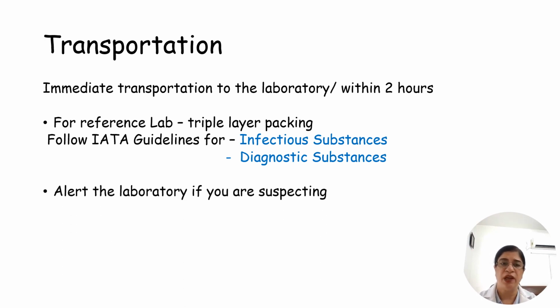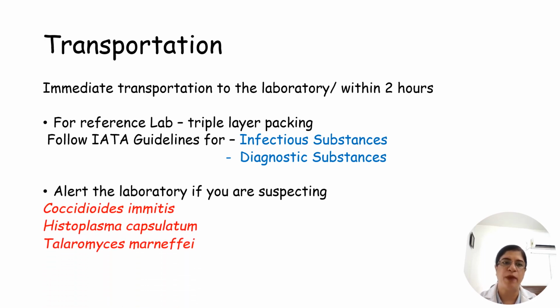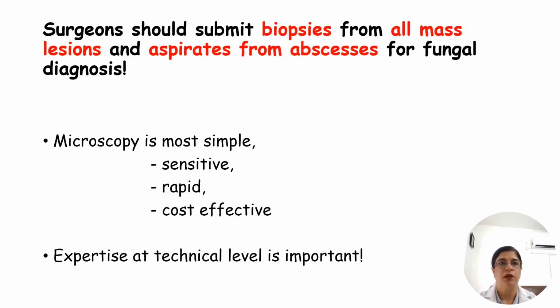Alert the laboratory if you are suspecting serious infections like Coccidioides immitis, Histoplasma capsulatum, or Talaromyces marneffei, which are a hazard for the laboratory personnel handling them. Some fungal isolates need special media like Malassezia furfur, so that should also be informed.